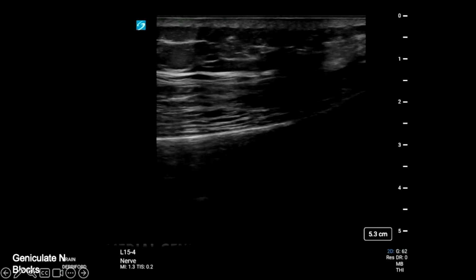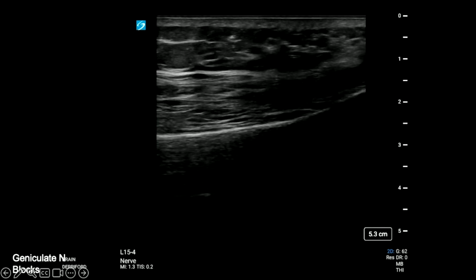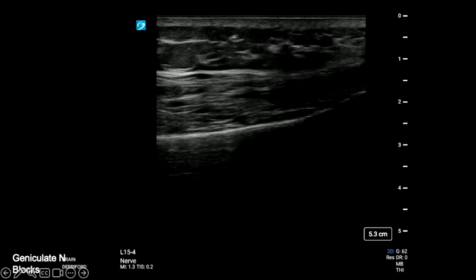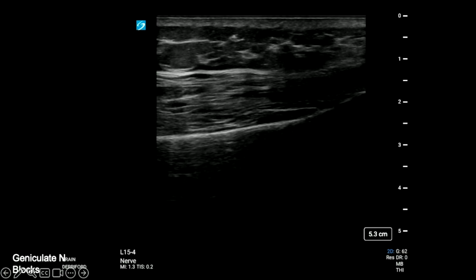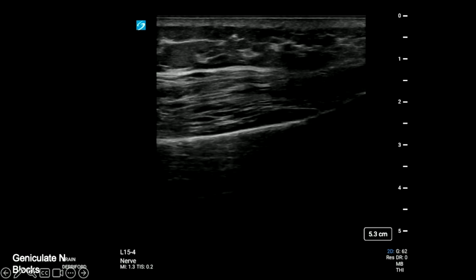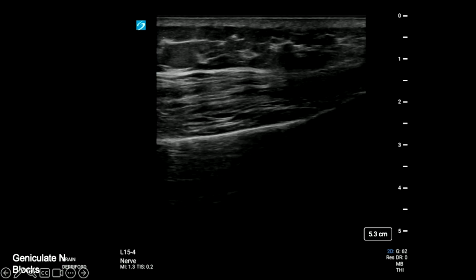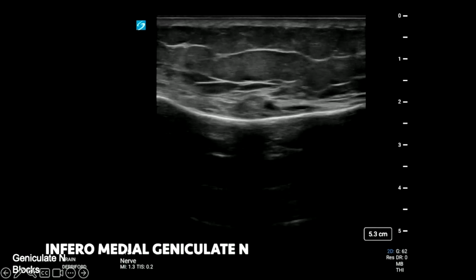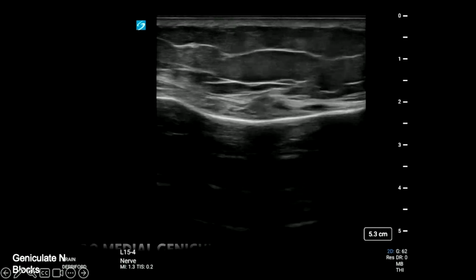Superior medial, again, needle coming in from the top, and again we're going to get that lifting off of the muscle layer. And we're just putting in 3 mils. That's sort of enough to get spread, which is good for conserving volume.